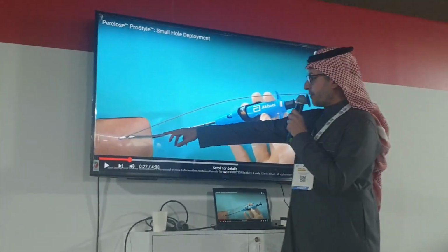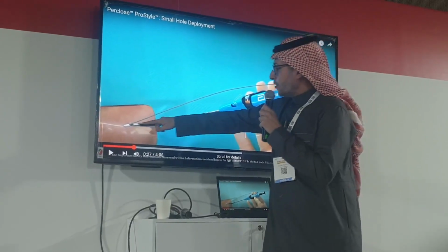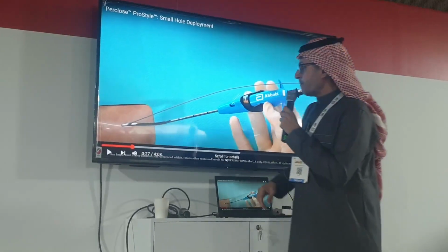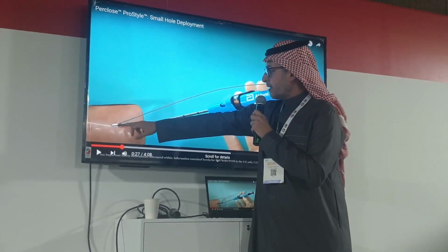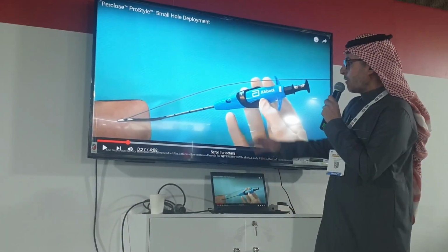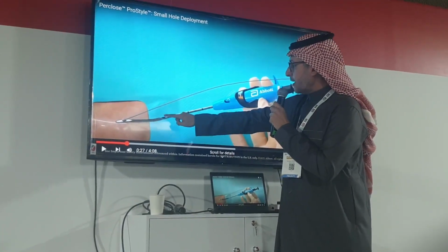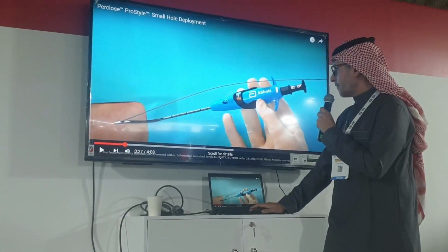So here you can access. What happens? The footplate is here, and the tube is what is accessing what's inside the lumen. Once you have the wire, once you see the marker here, you try to pull the wire, and once the wire is pulled, then you push it in until that footplate area is intraluminal, and you know that by the blood coming out of the device.